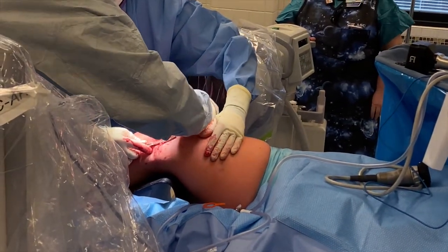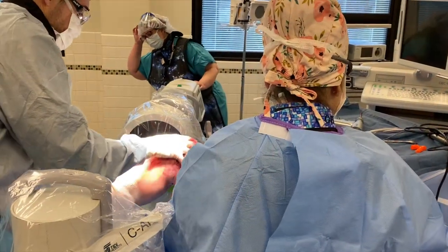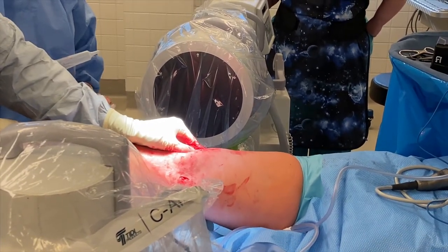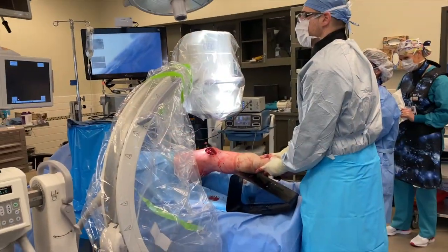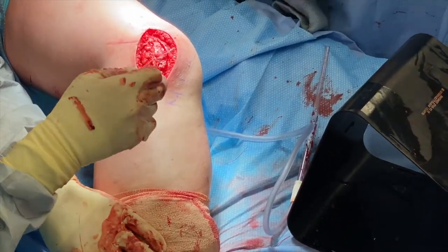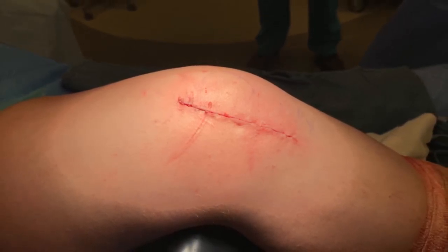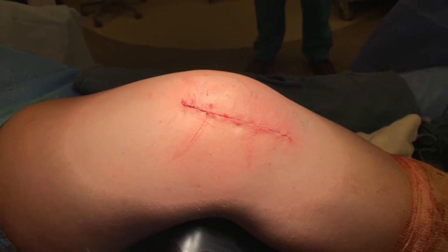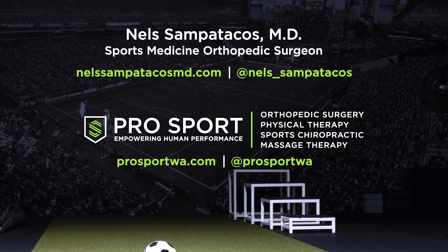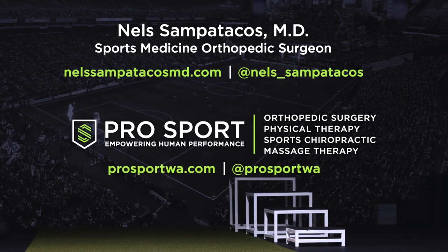Once the graft is secure in the femur, we have to dial in the tension just right so it's not too tight or too loose. We take final x-rays, examine the patella, and when we're perfectly happy, we close the incisions — lengthening those lateral tissues by about a centimeter and a half to help rebalance the patella. That completes our case. These patients go home the same day with no range of motion or weight-bearing restrictions, and in general they're a very happy group of patients with their new stable knee. I hope that's helpful — this is Dr. Nels Sampatacos with ProSport. Take care.